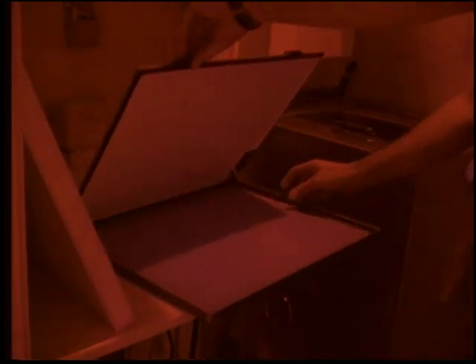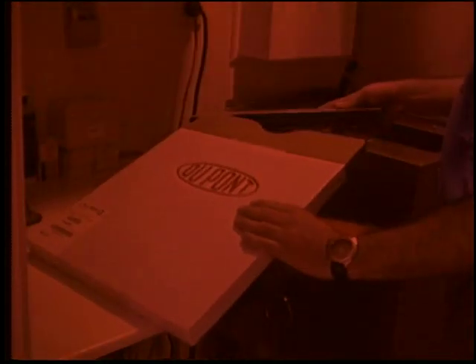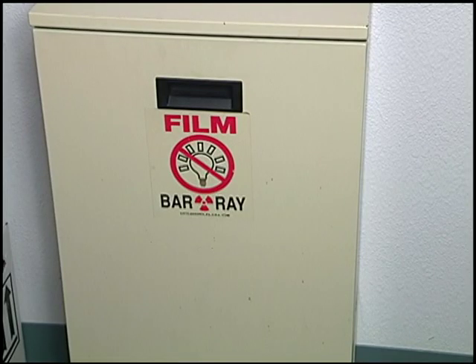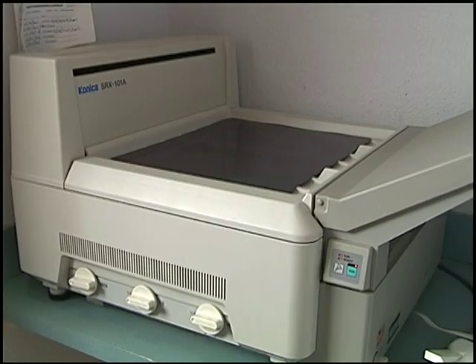With clean, dry hands, carefully remove a piece of appropriately sized X-ray film from a light-proof box. After removing a sheet of film and placing it squarely into the cassette, you should quickly close the box to prevent light from ruining hundreds of dollars in X-ray film. These boxes are sometimes kept in light-proof film bins to assure that light does not damage the film.